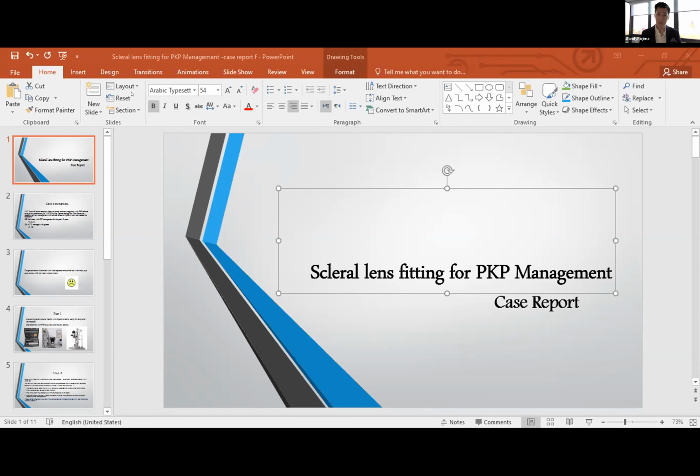But yeah, it's really kind of amazing that we can fit these vaulting scleral lenses that seal themselves as they sink into the conjunctiva. Their seal is even more significant over the course of the day. But really, I can't think of any studies that suggest that that lack of tear exchange is a problem.